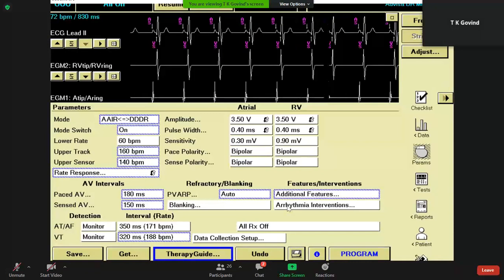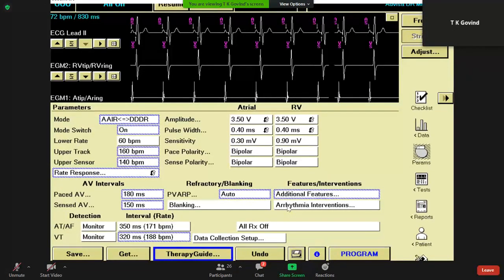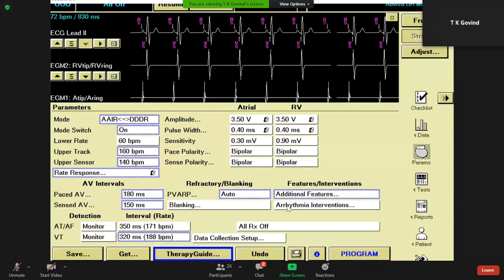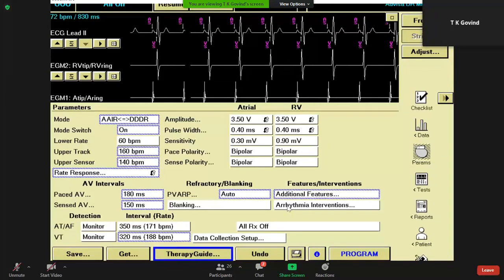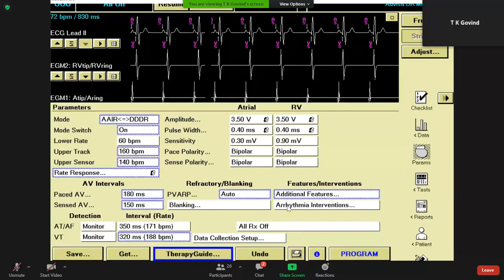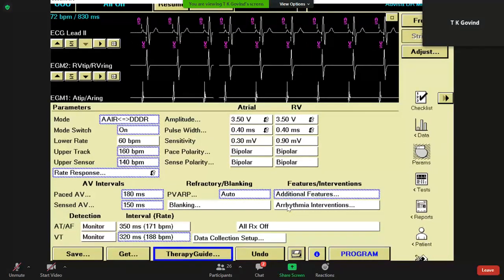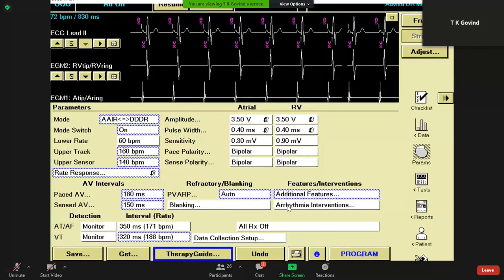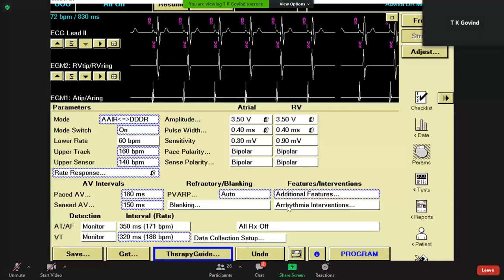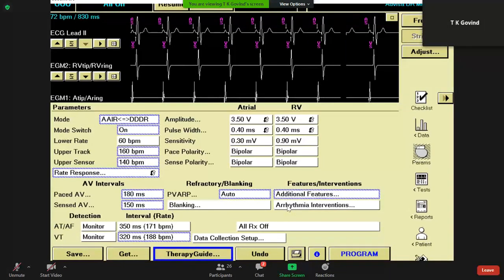So PMT is not necessarily always due to retrograde activation only. It happens because of an event that allowed the first retrograde activation. One common reason is a PVC, which is not in your control. But another reason for the initiation of PMT is loss of atrial capture. Let's say there is a loss of atrial capture. It does an A-pace, and then there is no atrial depolarization. It starts an AV interval and paces the ventricle. Now, without an atrial depolarization in a dual chamber pacemaker, pacing the ventricle is equal to doing VVI pacing. It's like you are introducing a PVC that might initiate a retrograde conduction. So in this case, the actual problem is not retrograde conduction. Although the patient has retrograde conduction, it is the loss of atrial capture that resulted in a retrograde activation.